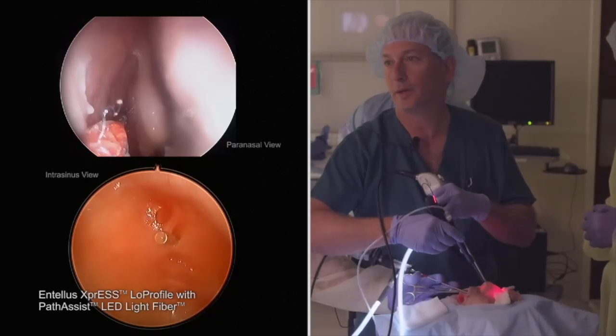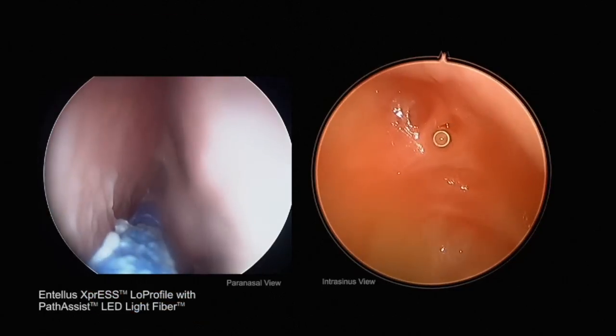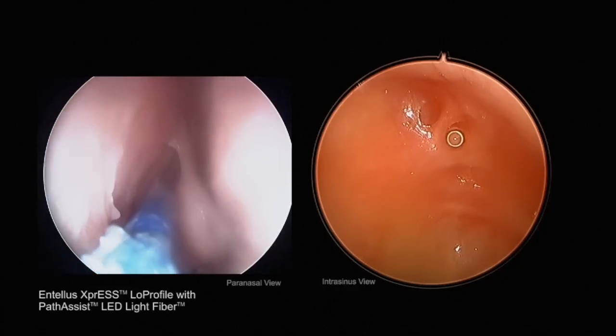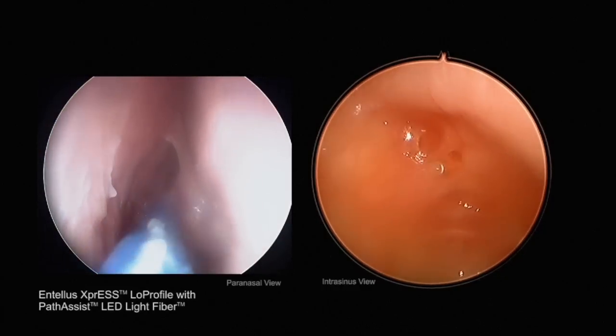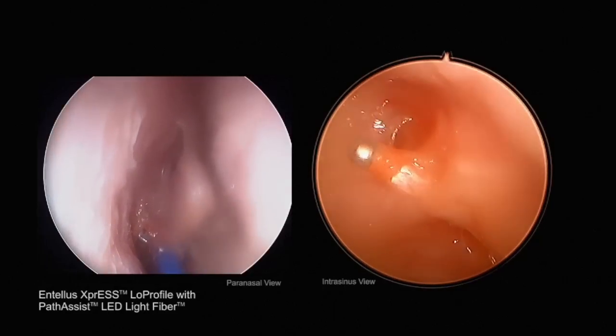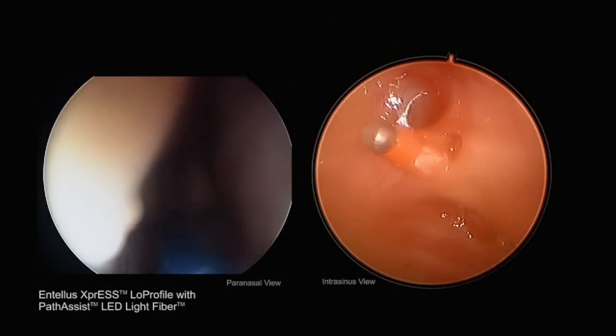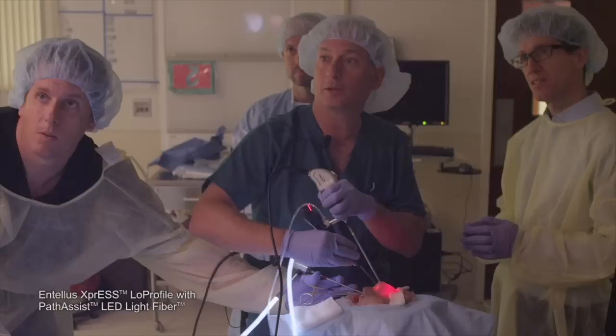So I'm passing the balloon all the way. I don't see it, so it's got to be at the tip right there. I mean, I don't want to force it, but I'm pushing up where I really don't want to do that.